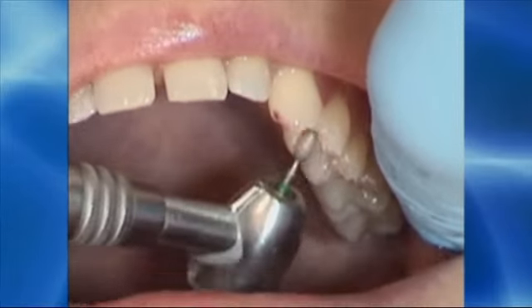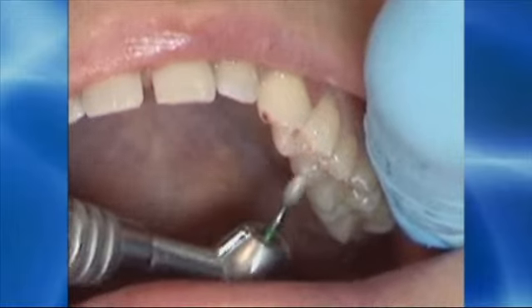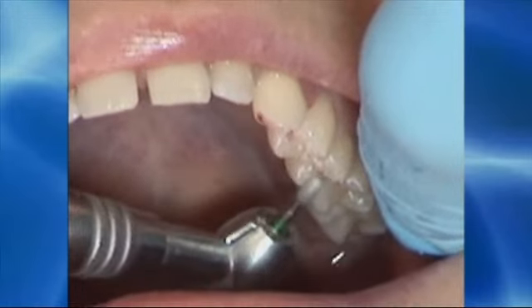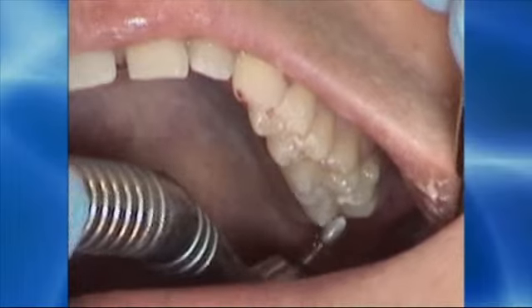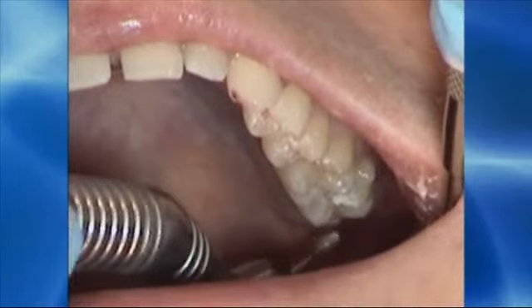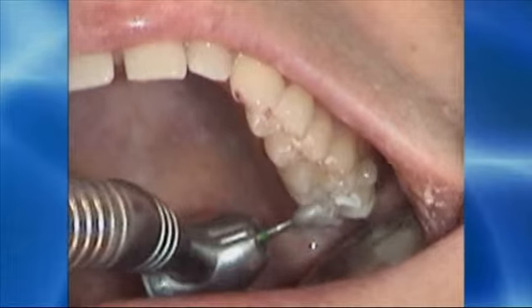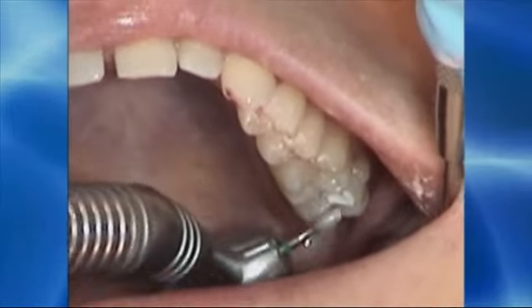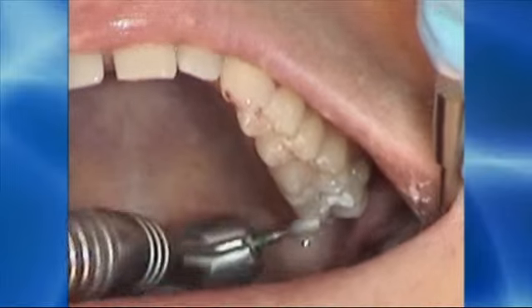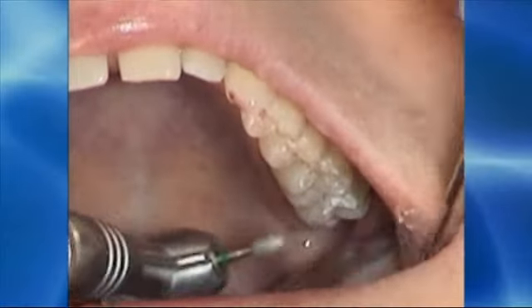And here I'm reducing the size of the lines around the central fossa and the mesial marginal ridge on the first premolar and second premolar. Now I'll move to the balancing incline on the inner aspect of the upper left second molar. Try to shallow that incline so that the lower tooth misses it as it passes by when the patient moves to the right. And this is a key area in this patient's treatment. And here I'm just refining these initial markings.